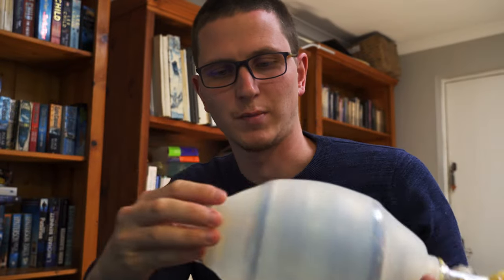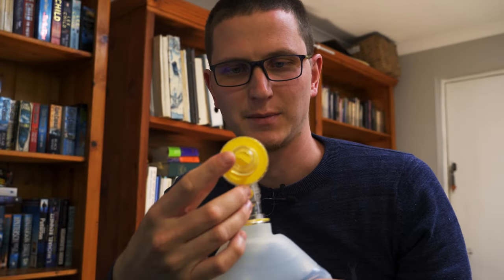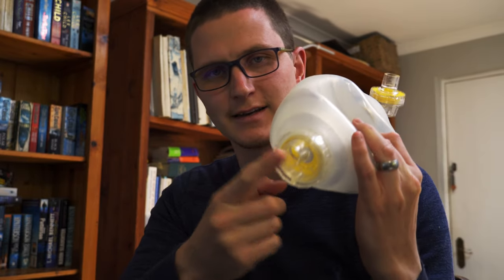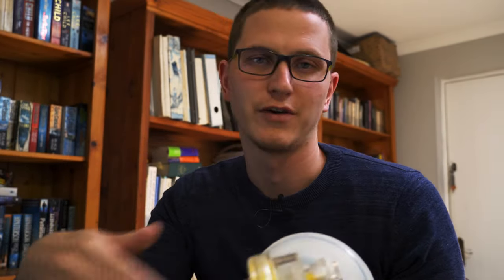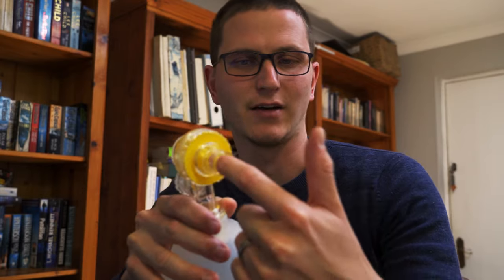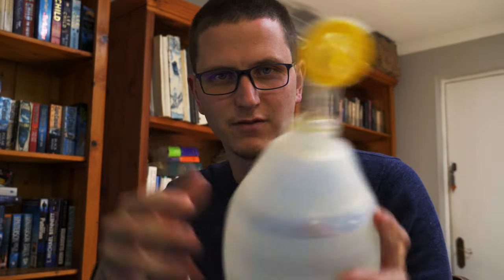The next thing to talk about is how the air flows and where it goes. When I squeeze the bag, air comes out of the front. When I let go, air gets sucked in at the bottom. You can put a reservoir on here and attach oxygen, which then provides 100% oxygen into the bag — though whether it actually delivers 100% oxygen is a debatable question.